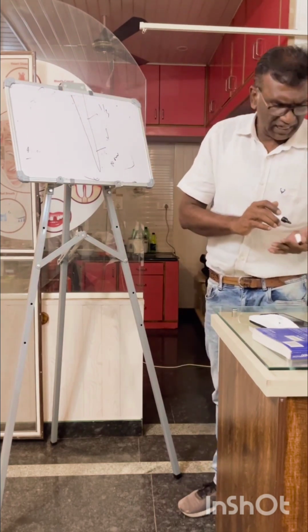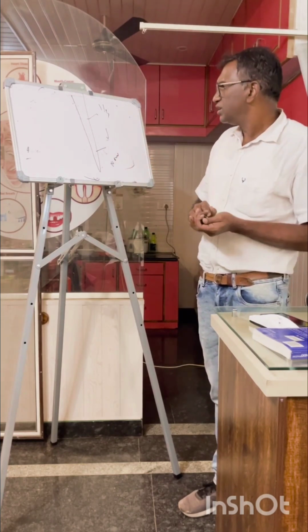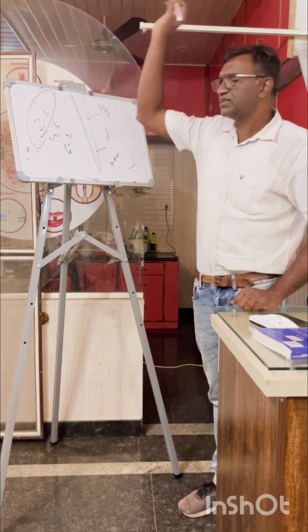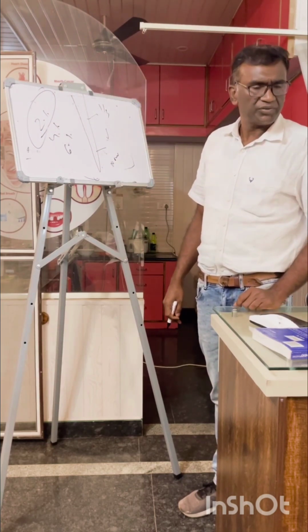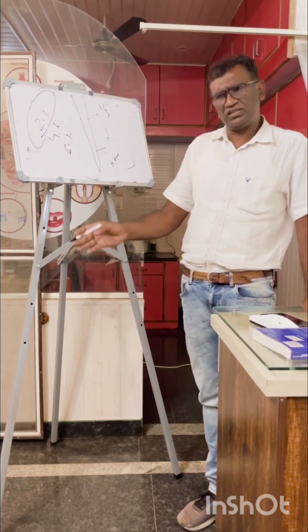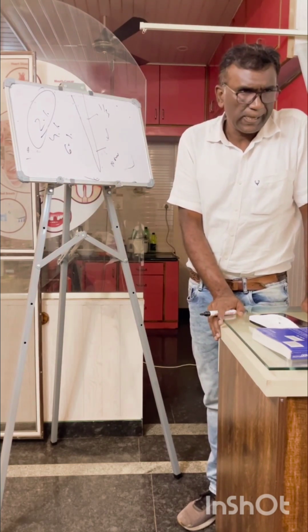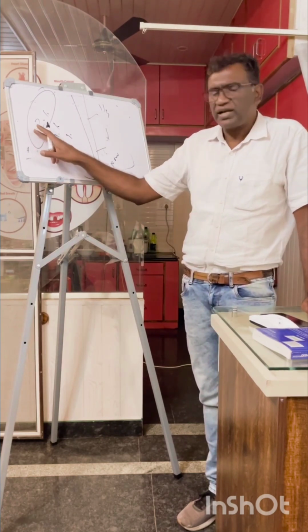So what is the naturally existing taper? The simple answer: 2%, 4% and 6%. What is this 2%? Traditional hand files come with 2%. Even today, 2% rotary files are also permitted. Glide path files are this 2%. They come only in the rotary system. Previously they used to come in hand files.